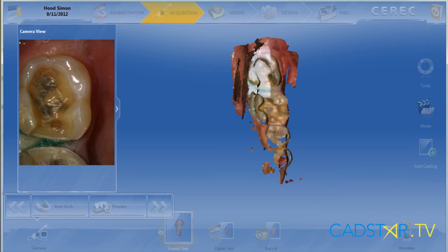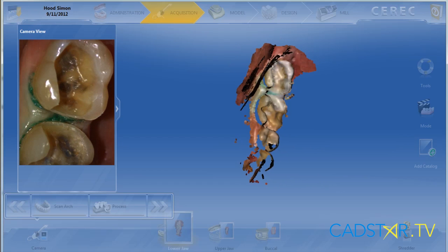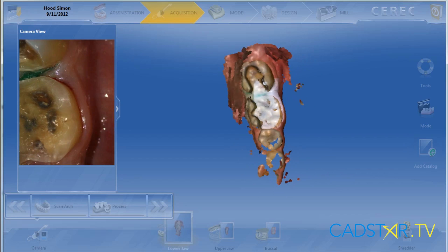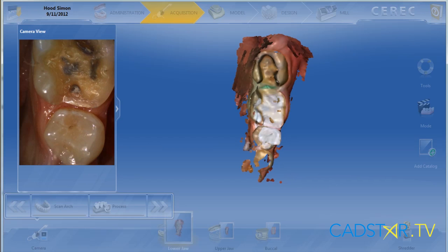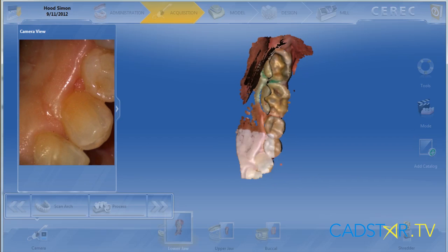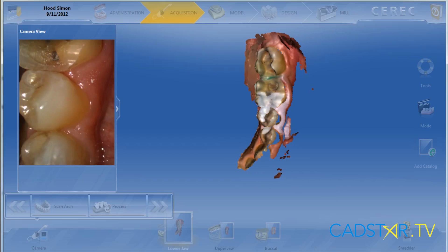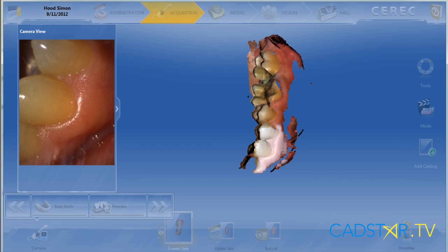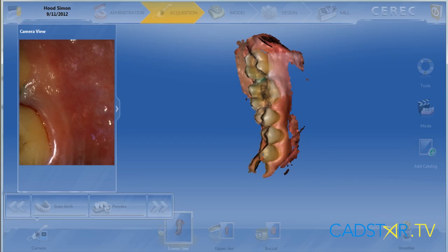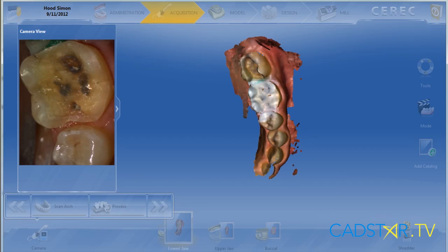At this point in time I want to gather as much information as I can over those preps, particularly when there's a box and those vertical line angles of the prep — we want to make sure that all that information is recorded very well. We also pitch next to the proximal contact, gathering the other cut data that will improve our virtual design later on. We're going to gather information up to the canine so we can document our bite well when we're ready to correlate our virtual models.